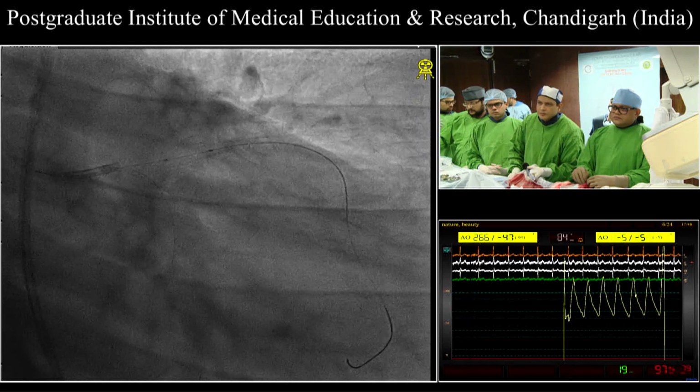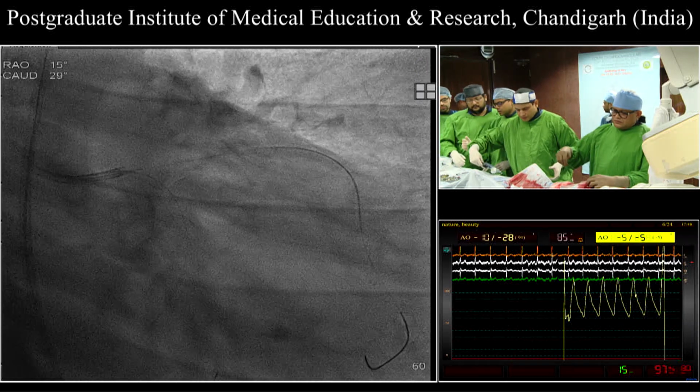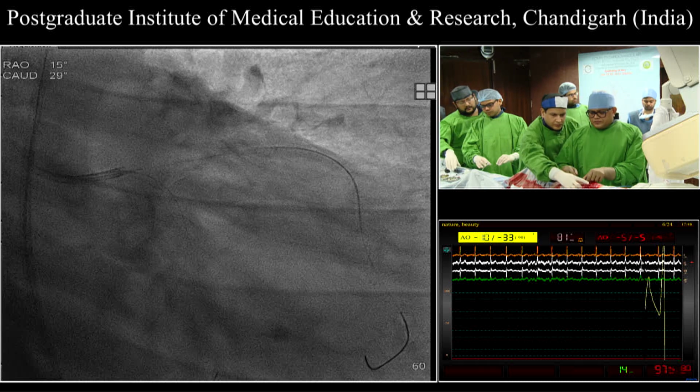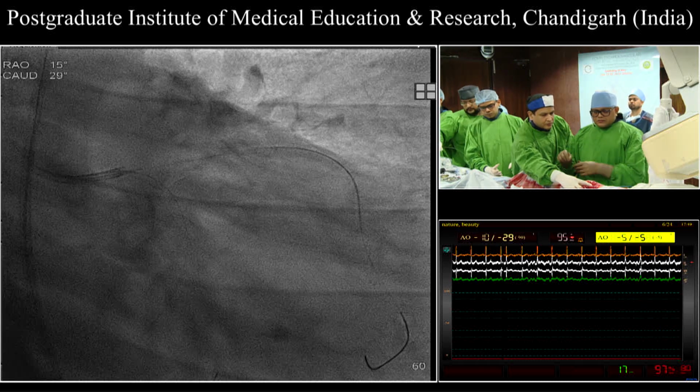if you have a truly underexpanded stent with calcium on the outside, you really have to discuss it with the surgeons up front, if it's a Lima graft instead. I agree, we have to prepare the lesion first.